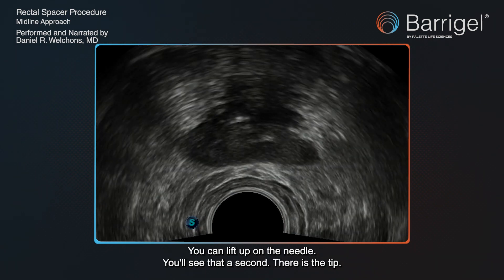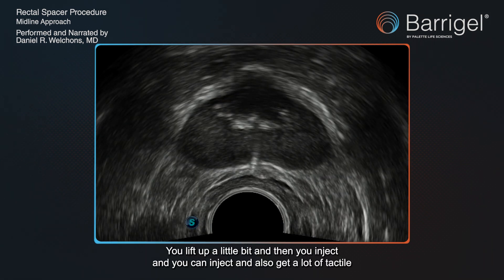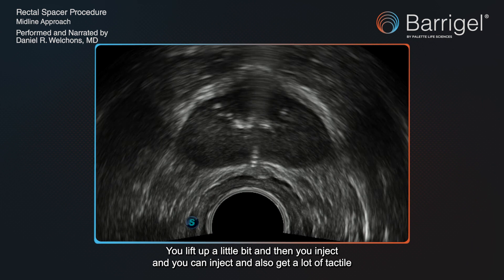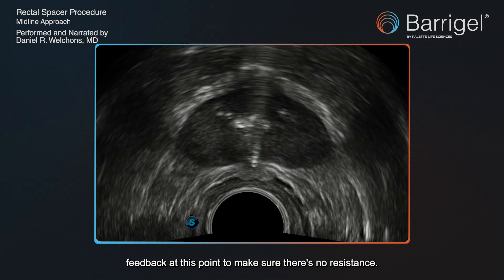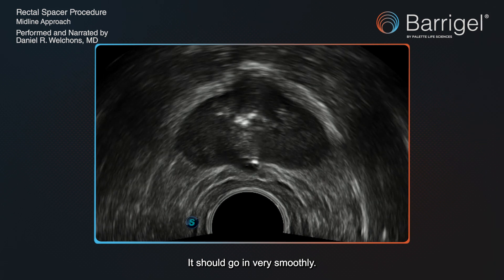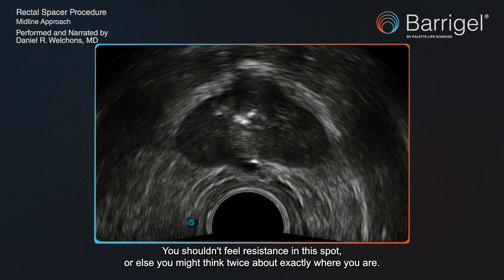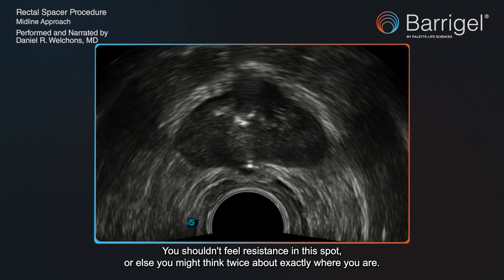You can lift up on the needle — you'll see that in a second. There's the tip. You lift up a little bit, and then you inject. You can inject and also get a lot of tactile feedback at this point to make sure there's no resistance. It should go in very smoothly. You shouldn't feel resistance in this spot, or else you might think twice about exactly where you are.